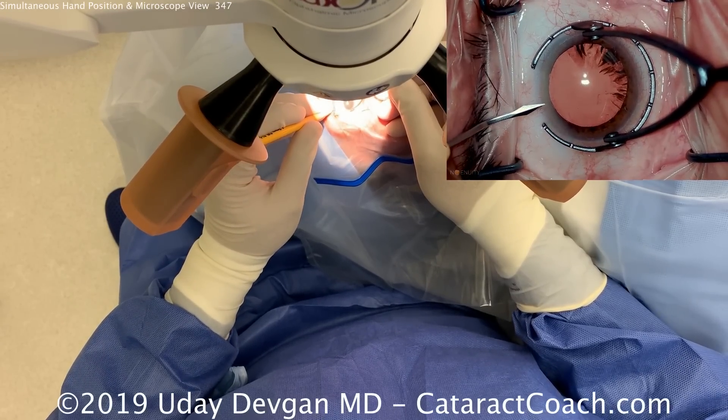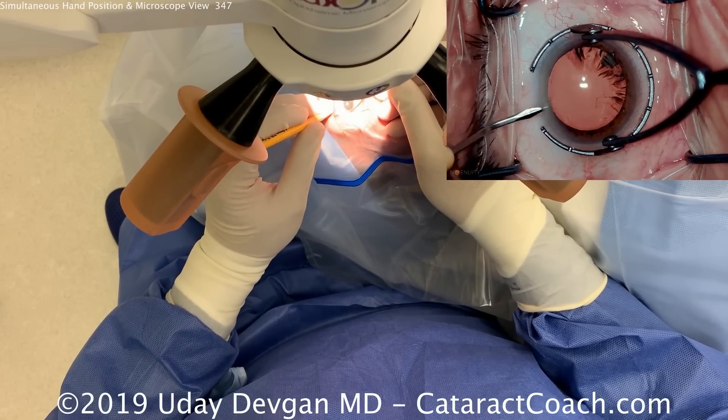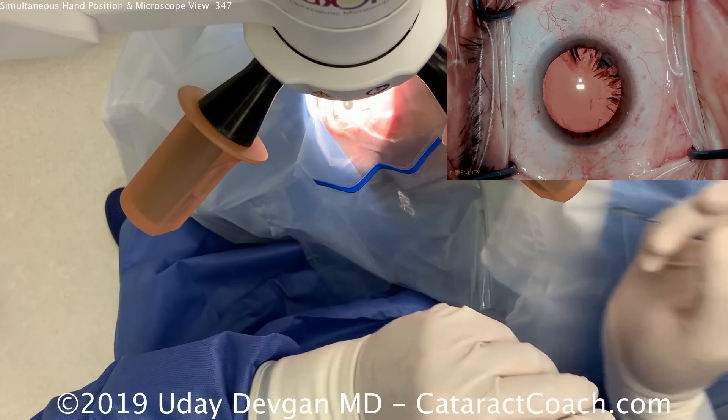Putting the fixation ring on the eye, using our side port blade to enter the anterior chamber, and making a clean paracentesis.